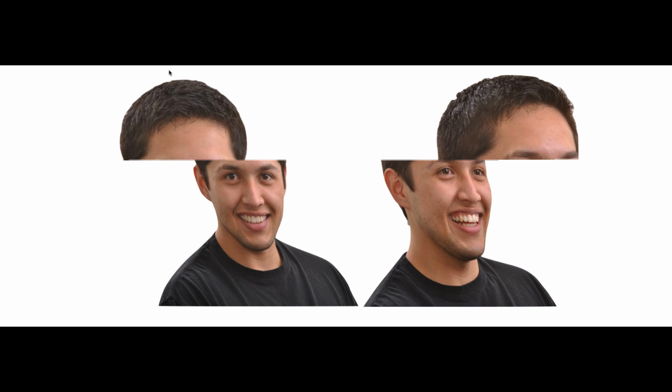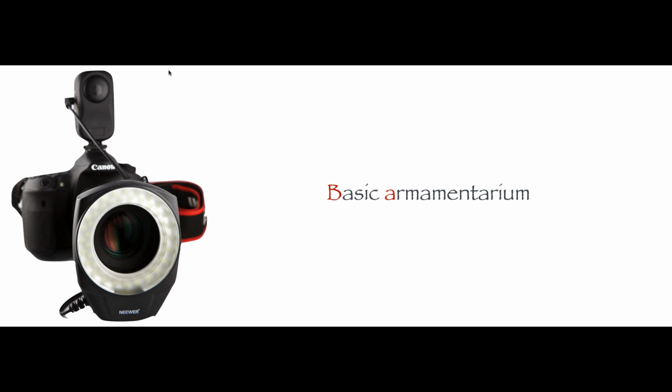And this is the final restoration. You can see in both of these shots, the left photo and the right photo, the biointegration of the tooth with my restorative material, because my restoration is only 4 millimeters from the middle third all the way to the incisal edge. And the rest of that, what you're seeing in his full smile, is his own natural tooth structure. So this is a very conservative approach.